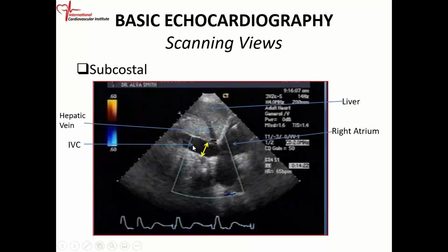So you have to measure the IVC, and you measure it just beyond the hepatic vein.